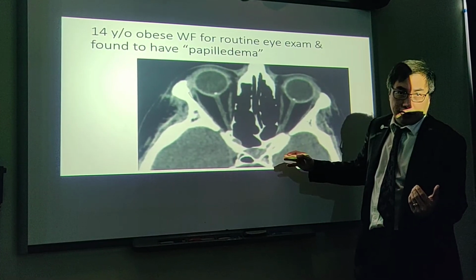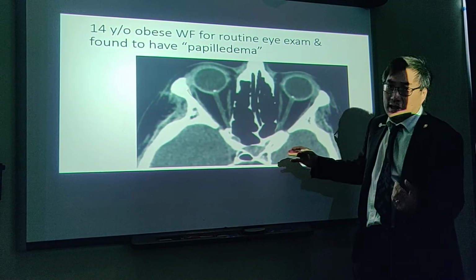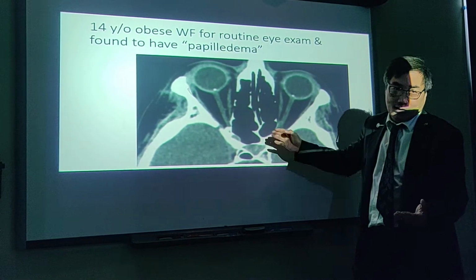Ultrasound is better in general for looking for buried drusen, however, but if it's not calcified, it won't show up on ultrasound and it won't show up on CT.